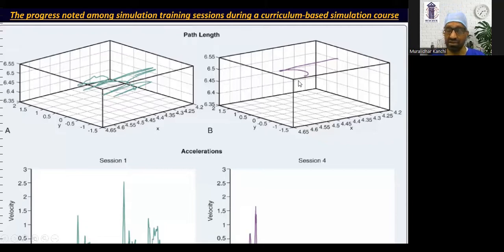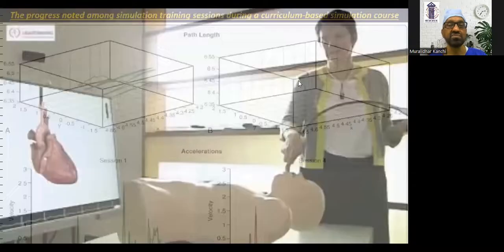The candidate can be graded and improvements can be suggested if the candidate is taking a lot of time to achieve a certain position, window, or angle of the TE probe to obtain a certain image.